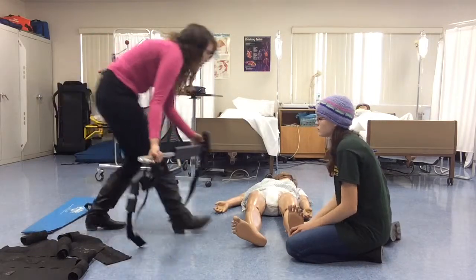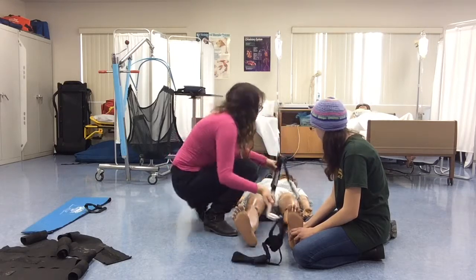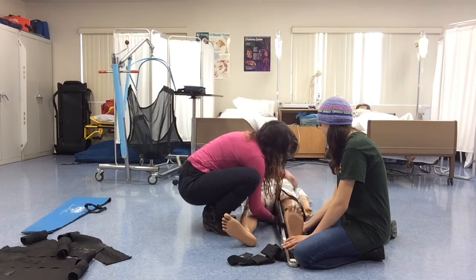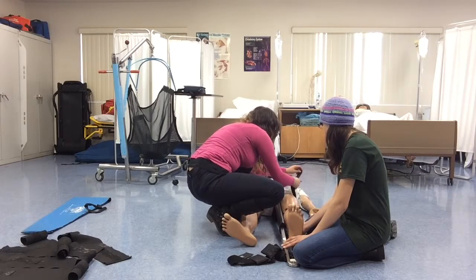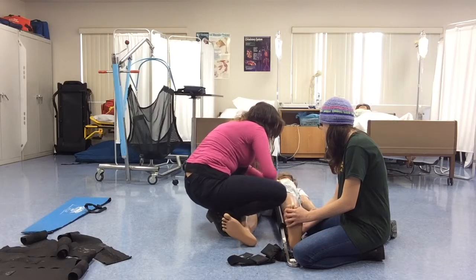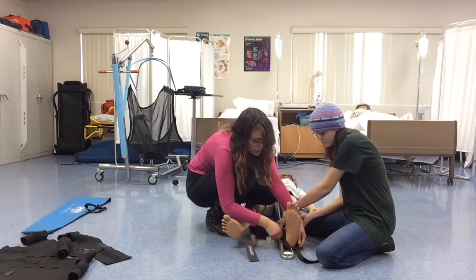So I'm going to line it up with her groin and measure so that the pole is by her ankle or her heel. Then I'm going to put the medial aspect of the T-bar against her groin and her injured leg. Okay, that's good. So I'm going to be putting on her groin strap first. I'm going to be putting it as high up the groin as I possibly can. Okay, so now that the groin strap is in place, I'm going to be applying the ankle harness. Okay, for a snug fit.